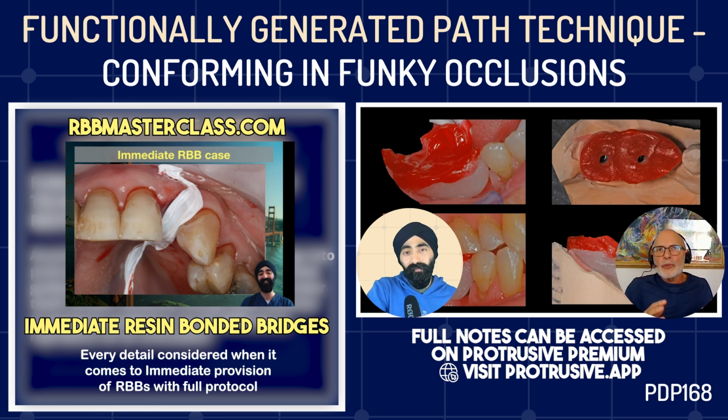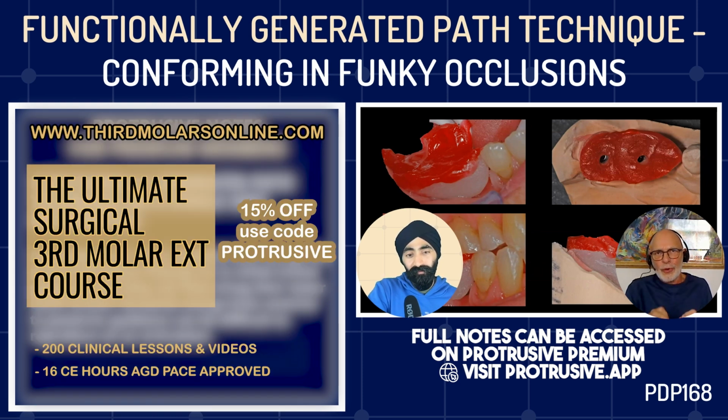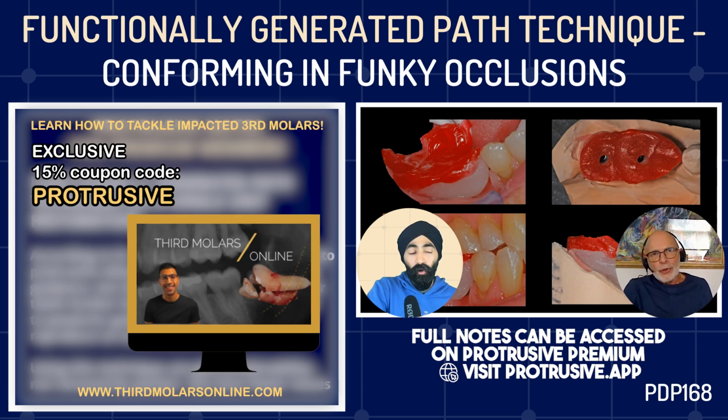I think in an ordinary, let's say it's even bilateral free end saddles, your guidance in a normal case will be coming off the anterior teeth. So really all you're worried about is your intercuspal registration to be correct, because the rest of it's fairly easy for the technician. It's where you don't have anterior guidance. I think that's the one that it's easier in the long run for both you and the patient to do it predictably using this technique. I just think it's not necessarily quicker, but you have less issues, and you know who pays for it if you have to remake it because it's completely wrong. And so, well, it gives your technician extra information, and it increases the chance of you getting it right the first time. And it's a nice, clever little way.